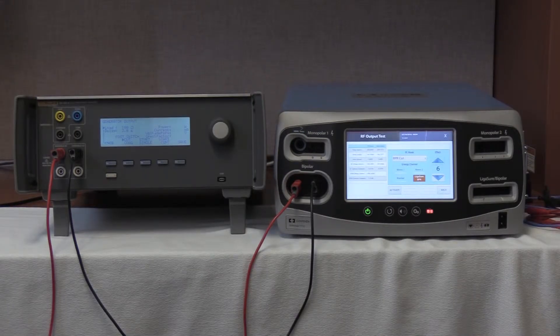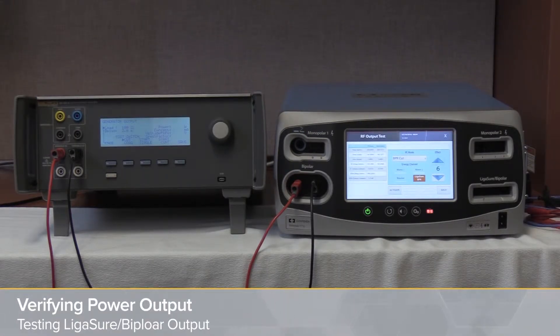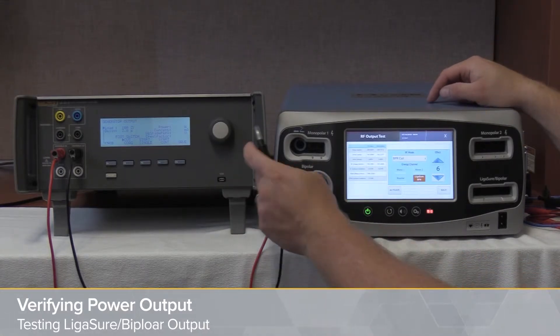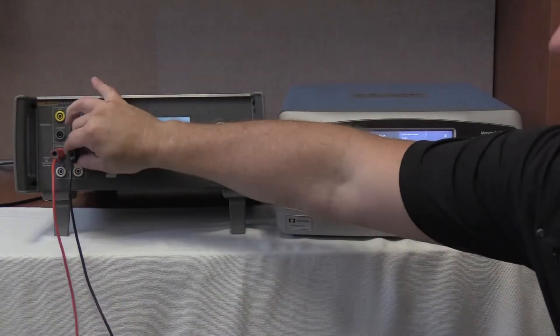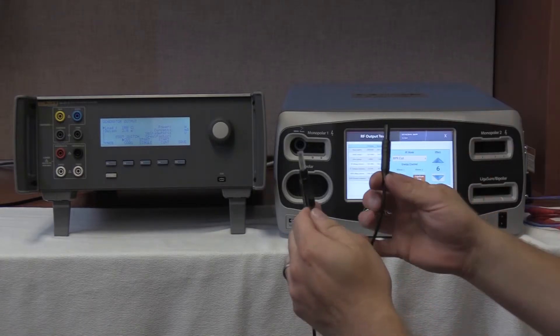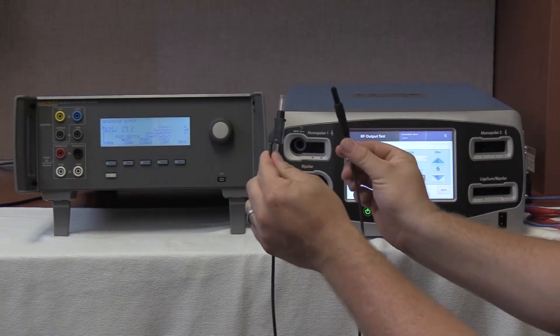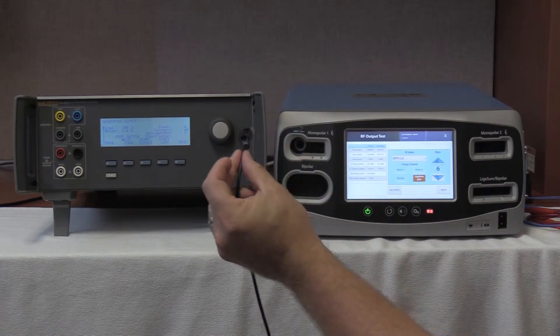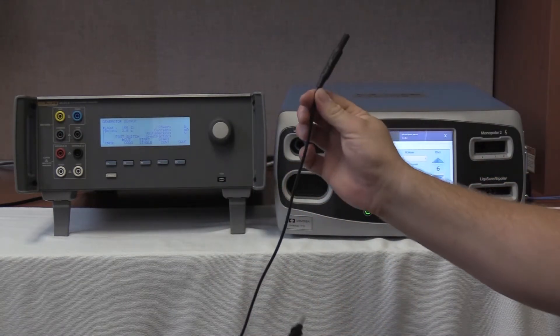Final section of testing covers the LigaSure and bipolar output of the Valleylab Covidien FT10. We are going to disconnect the bipolar cables used in the previous step and replace them with the bipolar LigaSure cables found in the QA-ES III. When looking at the LigaSure cables, you can see a distinct difference: this is the bipolar cable, this is the normal output cable, and this is the bipolar LigaSure cable.